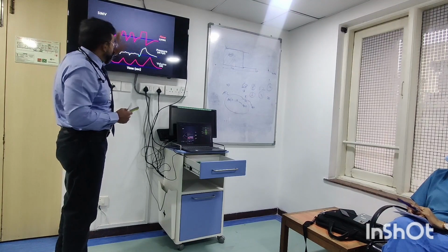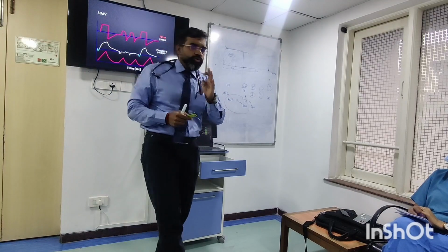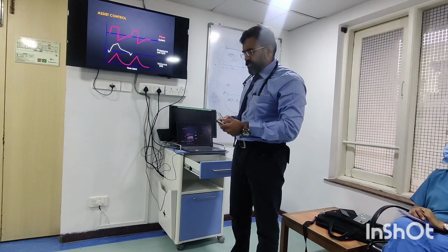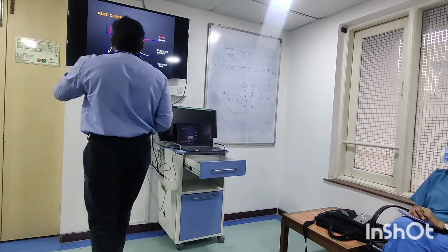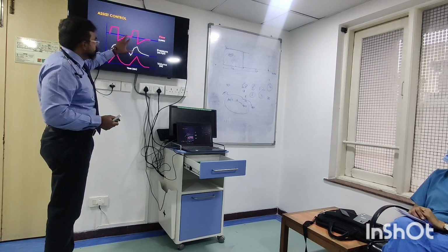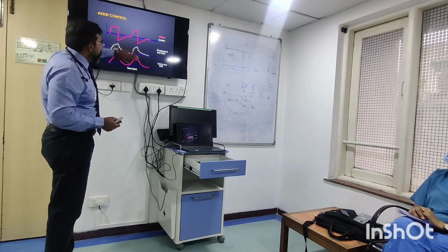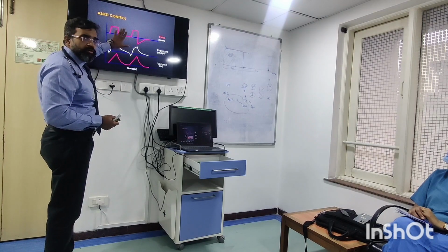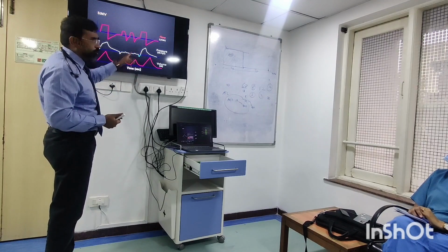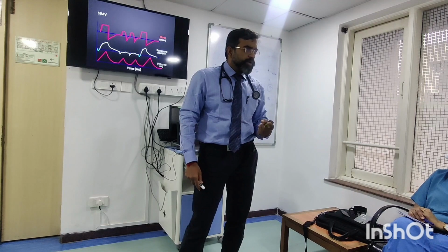In the earlier breath you saw there was mandatory ventilation. Now in the middle, if the patient tries to breathe somewhere here, in this phase, he cannot do anything. If he wants to take an inspiration here, he cannot get one. In a control mode, forget the trigger, the patient cannot take it. That was what the situation was. Now what has happened is, in this kind of mode, it has... clear on this?